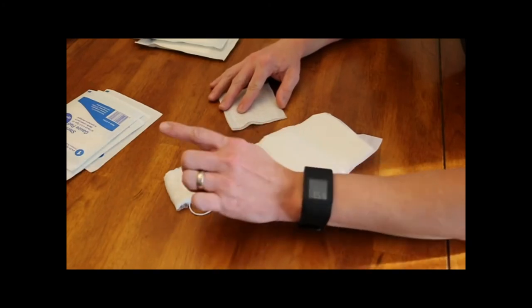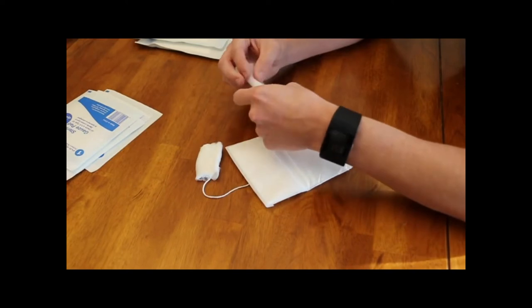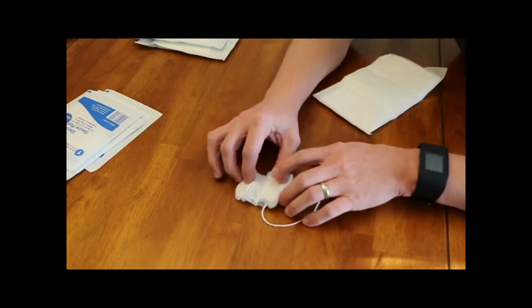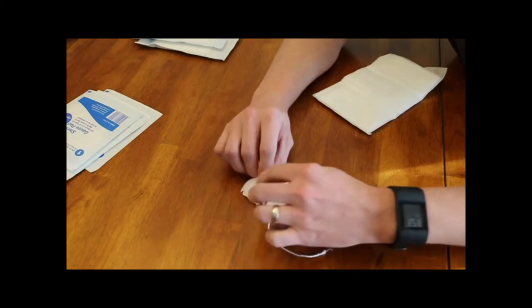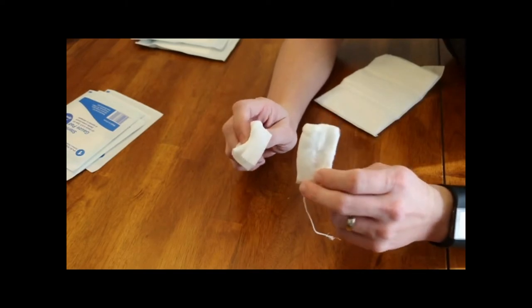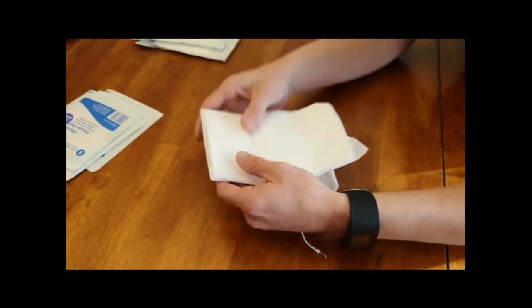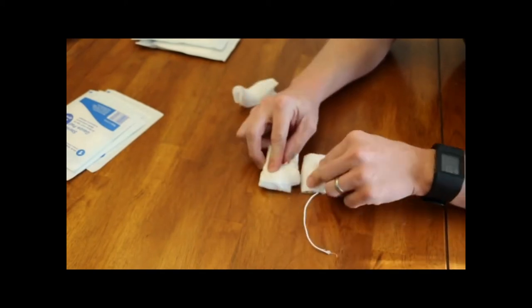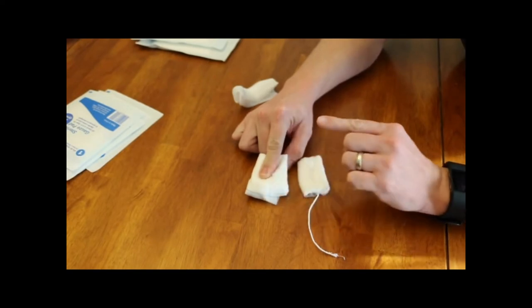Now let's compare these to the gauze that's actually in the tampon. So if we fold the 4x4 up, I get it kind of the same size. You can see it's pretty close. The tampon is more dense, but you're fairly close. And the 4x4 is the one we said we'd use for minor bleeding. Then we have the 5x9, which we use for moderate to heavy bleeding — and you can see the 5x9 is going to absorb a lot more blood than the tampon.